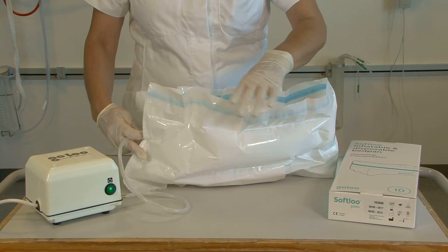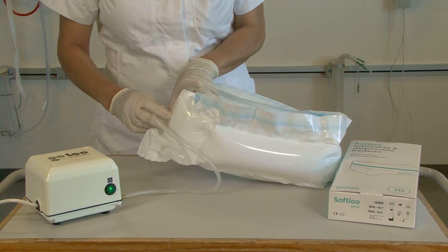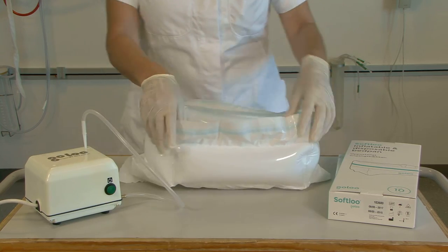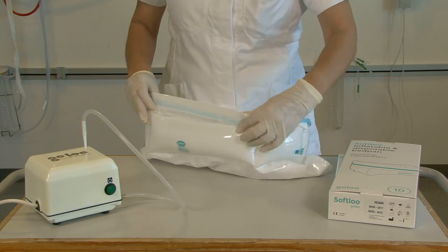Once the bag is inflated, remove the nozzle and turn off the pump. The air intake closes automatically so there is no release of air. Roll down the upper edge of the bag and it is ready to use.